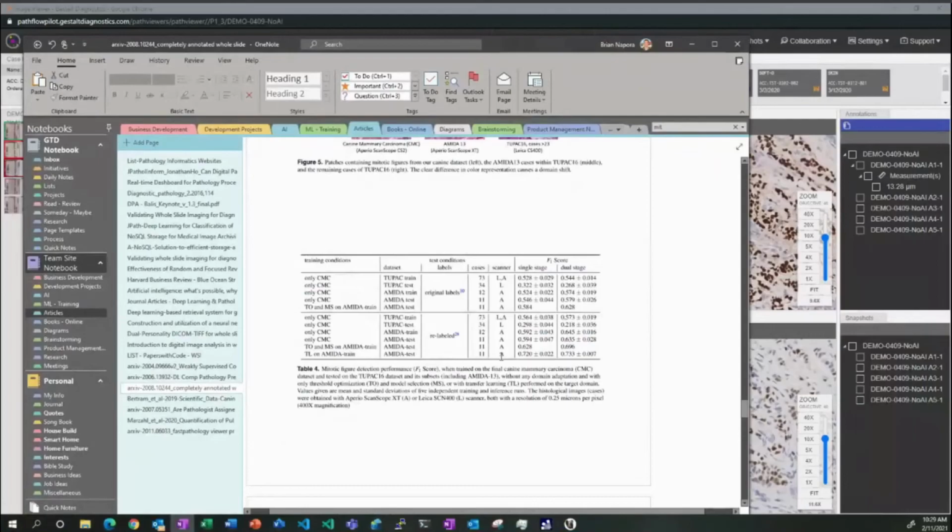Yep, and that pipeline is something that the folks at FAU are doing and have published on. This is the chart from one of their most recent papers, where they were doing an initial object detection pipeline and then tuning that model with a classification.